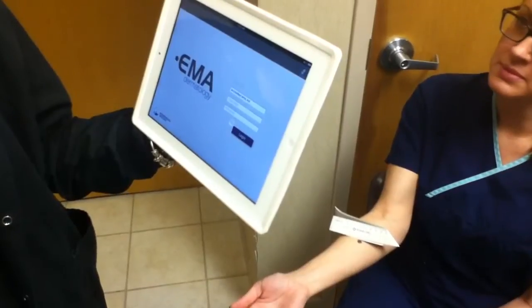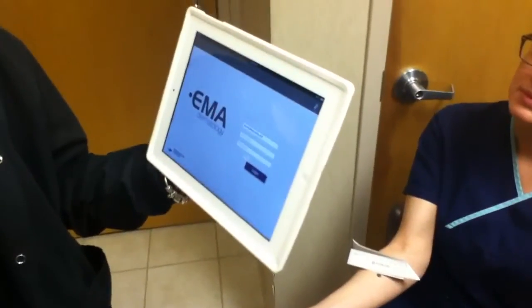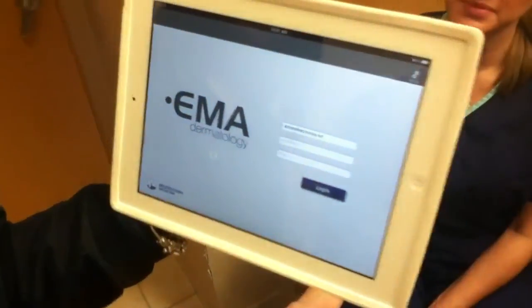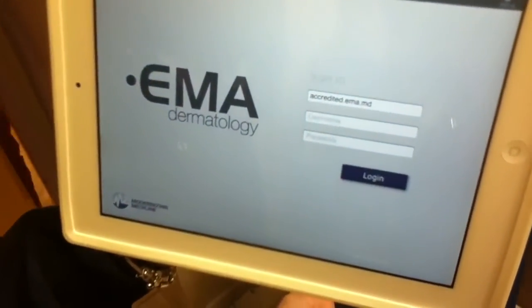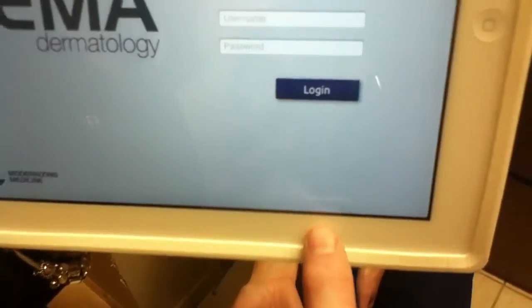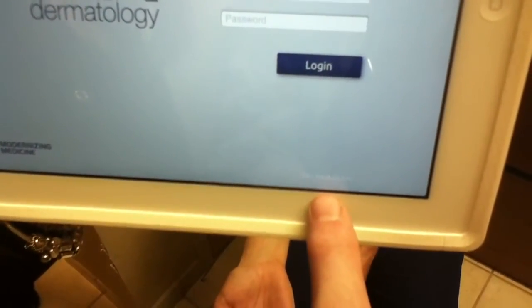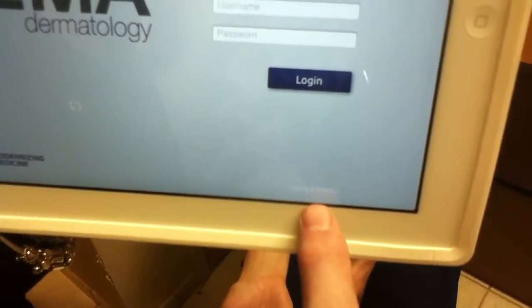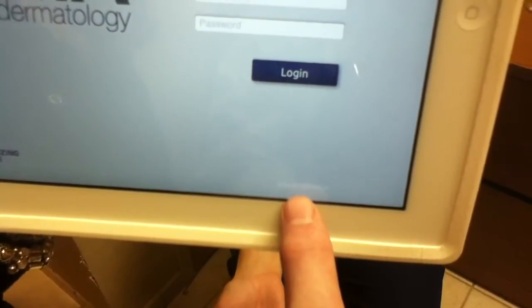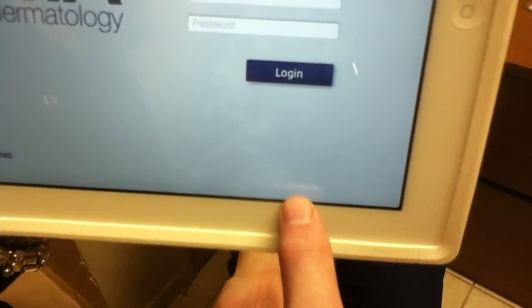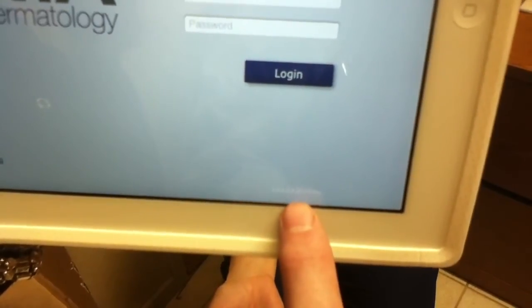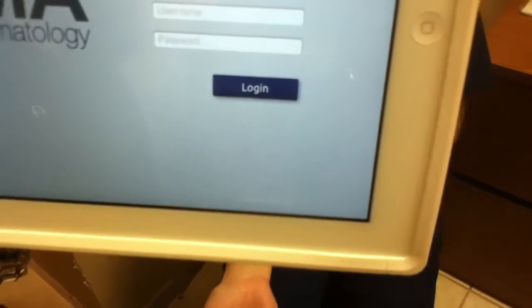The first step is to make sure that the version of EMMA you're using is completely updated. You check by looking at the bottom right-hand corner of the screen, and it should read 3.0.0.6.4 (3.0.0.6.x).